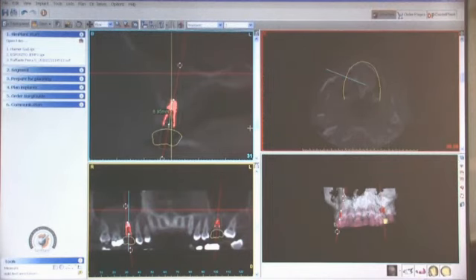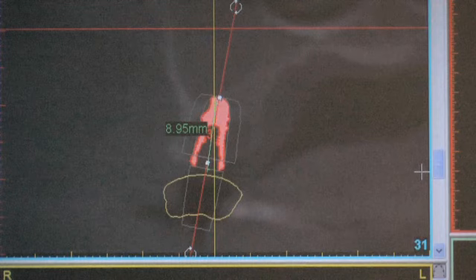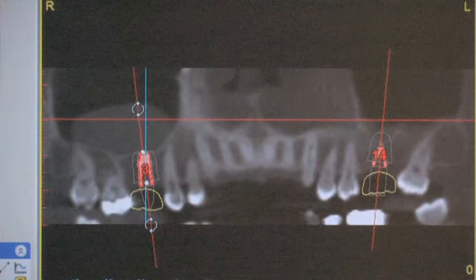measure the amount of bone that we have in 3 dimensions. And what's most important is taking it one step further in a case like this, is taking a software program like SimPlant and being able to virtually place the implant prior to ever touching the patient is a tremendous advantage for me. So rather than guessing or hoping that I can get an implant in the proper position, I'm going to know exactly, precisely where I want to place the implant, and if I'm able to indeed place the implant without doing more invasive procedures, such as a true sinus elevation or sinus augmentation.